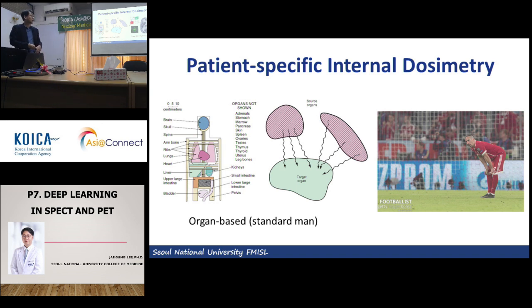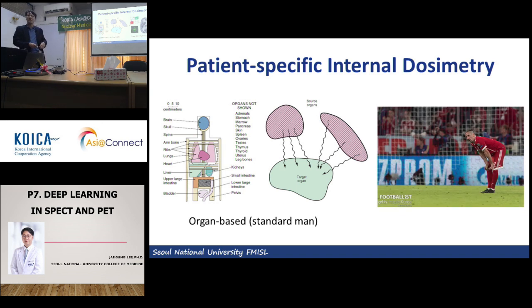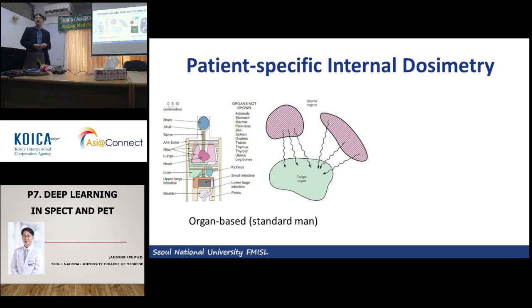But the voxel-based Monte Carlo simulation is a procedure that requires really long time and very high computation resources. So our idea was whether we can replace this Monte Carlo simulation by deep learning networks.